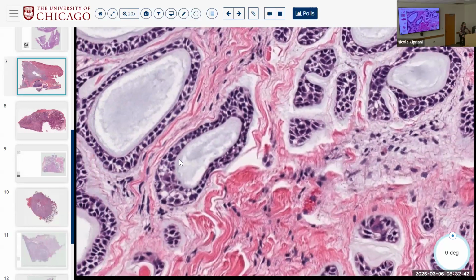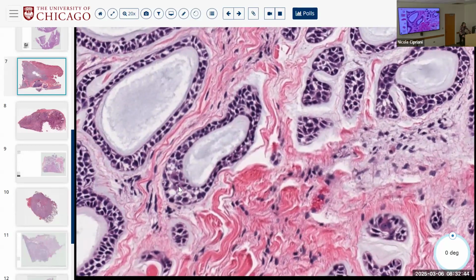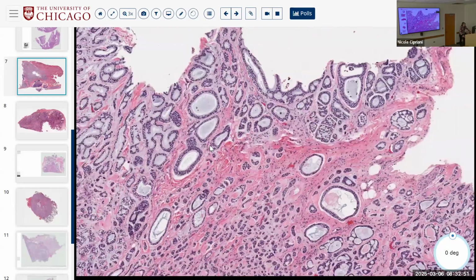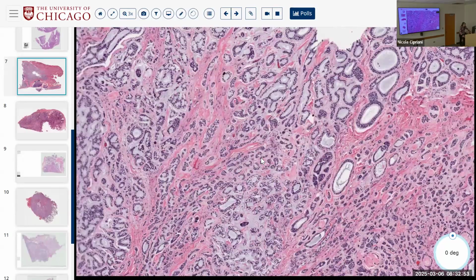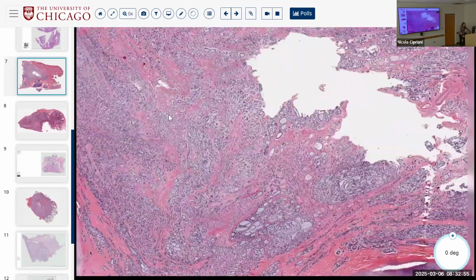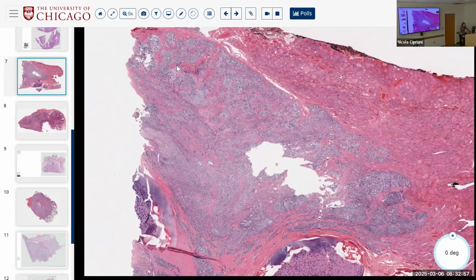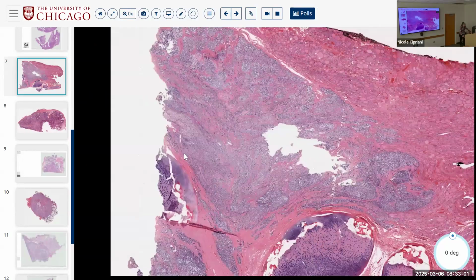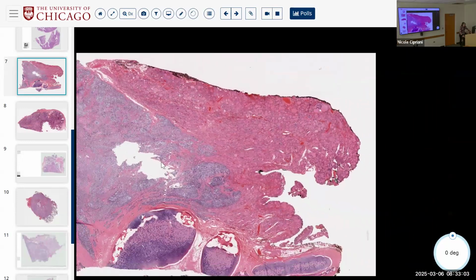We already talked about how even though these cells look kind of similar, these are of epithelial and myoepithelial cell differentiation. So your P40 and your c-KIT will highlight those. We've already seen that in the presentation, so I'm not going to belabor this. Okay, all right, adenoid cystic of the trachea with invasion into thyroid cartilage.